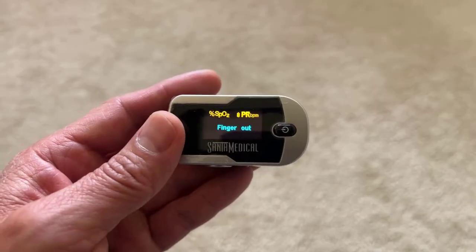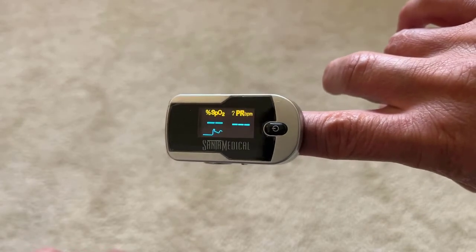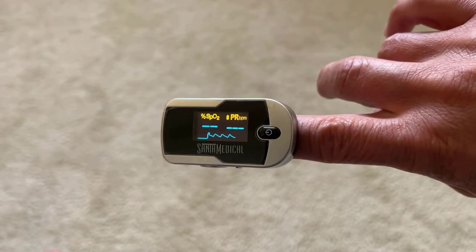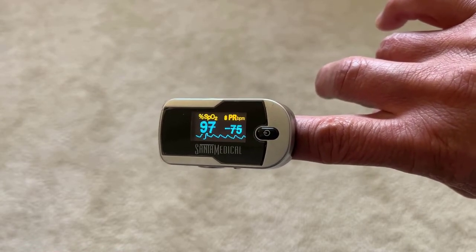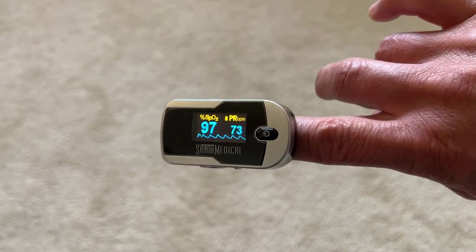Let's check it out. You can see it's quite easy to use, but one thing to keep in mind: although it's still accurate with lighter nail polish, it might have a problem with darker or thicker coverings, so keep that in mind.